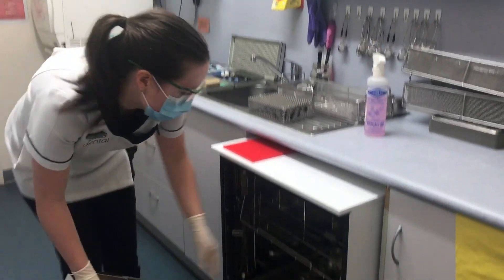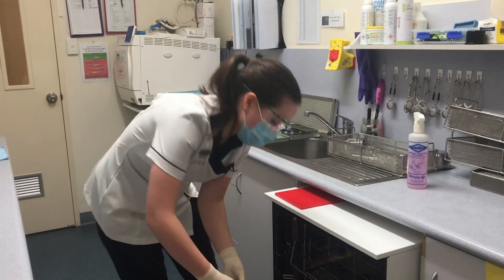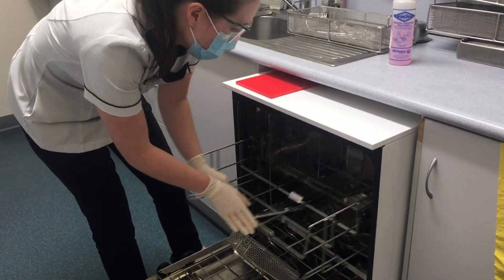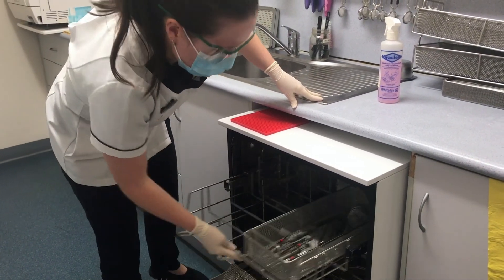Just slide it out until it's open. Because the triplexes are hollow at the end, we do make sure we stand those ones up on the water tray. Then we just slide our basket in on top.